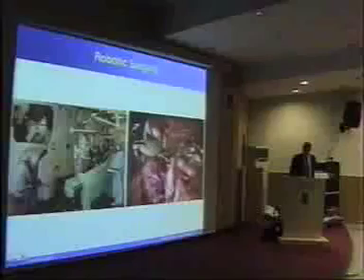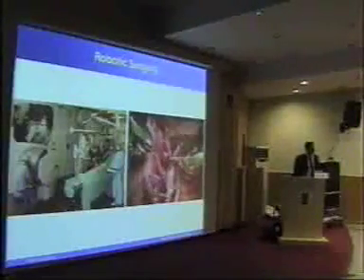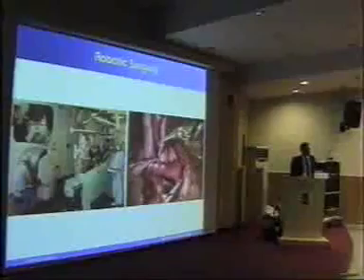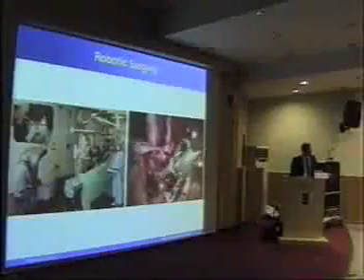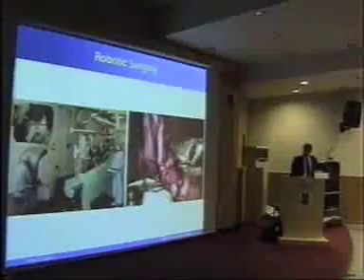Look, robotic surgery is here to stay. And actually, my view is a similar view to many other surgeons, although I don't do robotic surgery. This is a demonstration case. It's very good. It works brilliantly. It takes longer than conventional laparoscopy, and those people that are good at conventional laparoscopy are now telling me that they're not going to abandon it for the robot. The robot takes more time, it costs more money, and in the majority of things that you've seen, it probably doesn't enhance things.